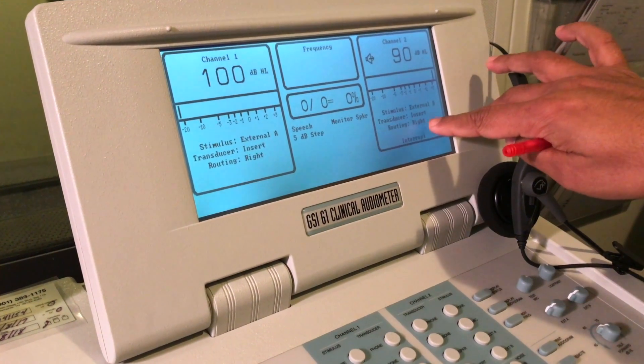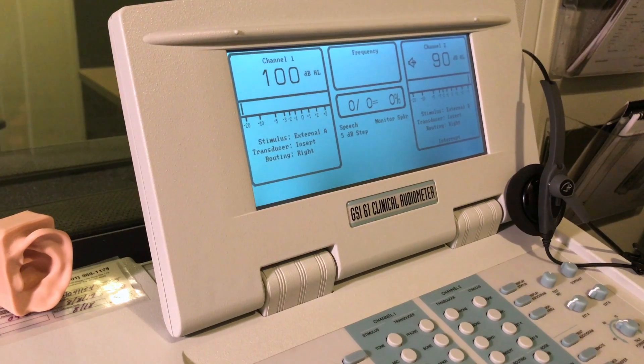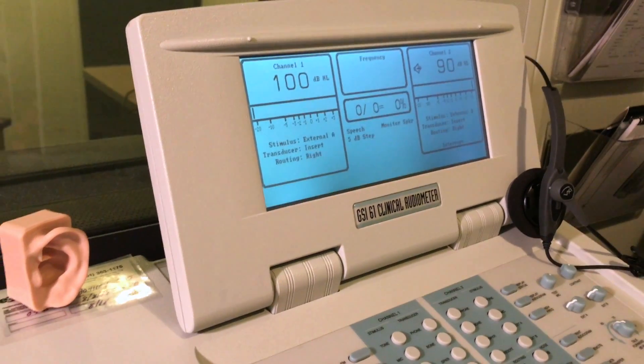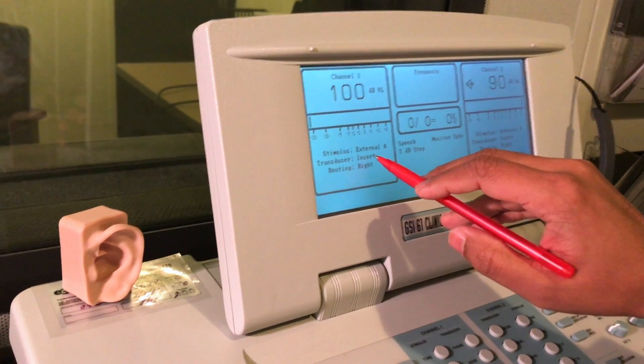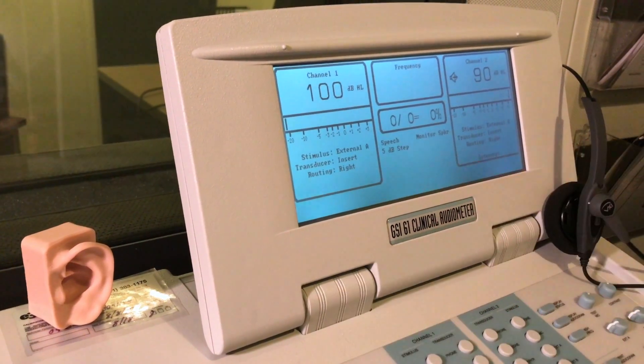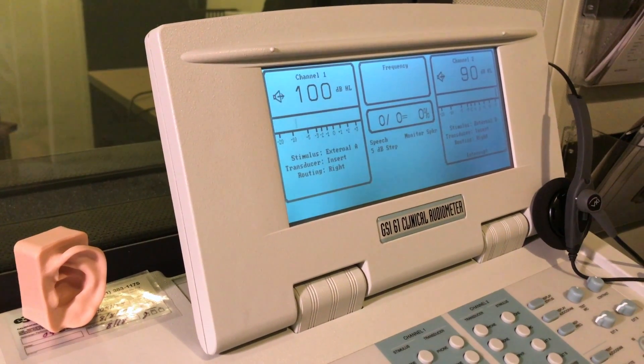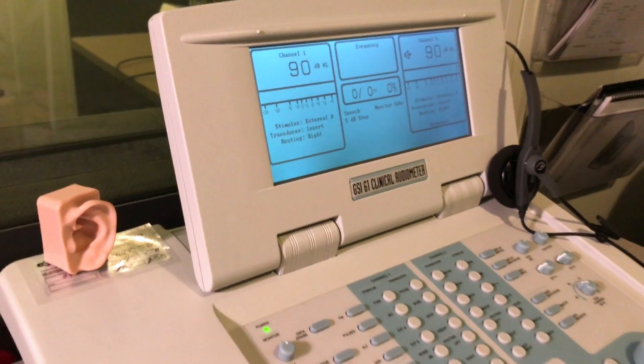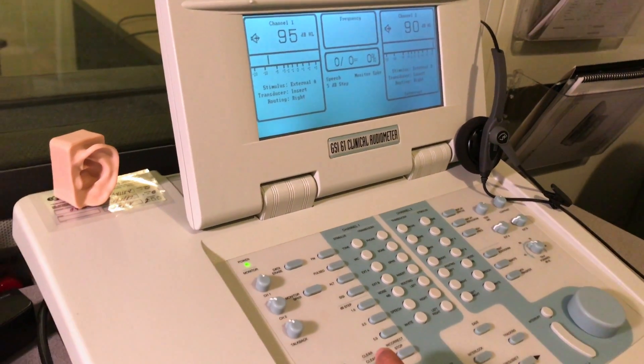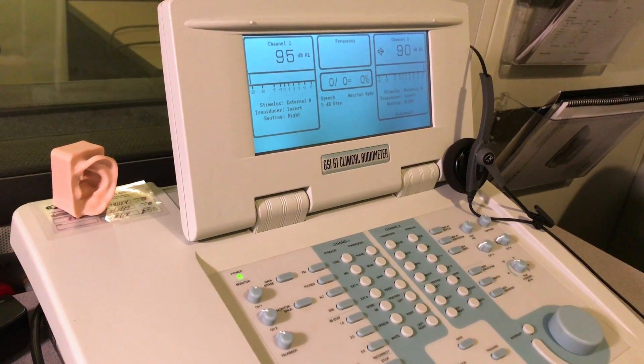Press interrupt so now the noise is routed to the right ear. All you need to do now is measure the person's threshold using the tone in the CD. We're selecting external A insert and the tone is going to the right ear. Use channel 1 and play the tone. Let's just assume that the person's threshold now is at 95 dB. Mark that on your audiogram.